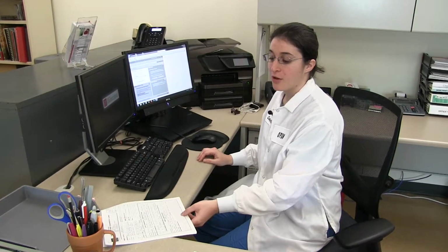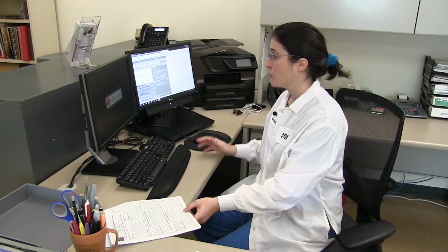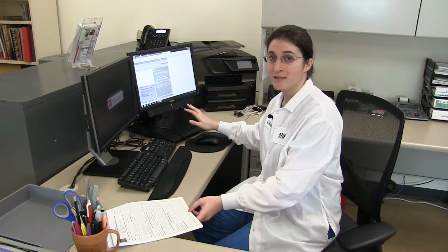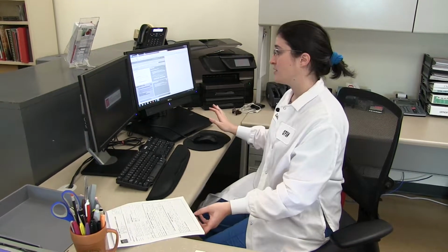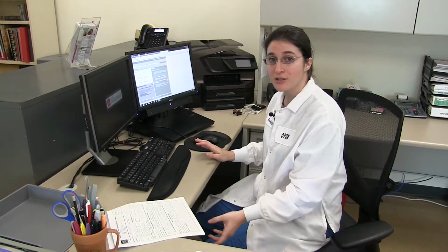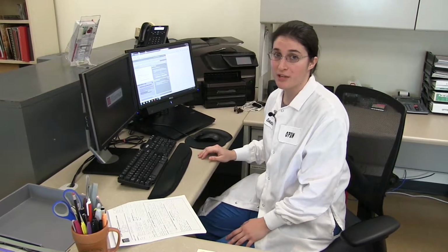So once we have our results as to if there's a pathogen or insect on the sample, we log it into our database, and this is where we generate a report for all of our clientele. These reports will give recommendations, if there are any, as to what that client can do for their sample. A general rule of thumb is that samples take between 4 to 14 days here in the lab before results are generated. We hope this walkthrough of the process of a sample is beneficial for the clients.